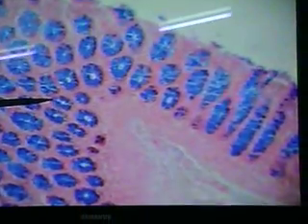There we can see some of the blood vessels, some of the colic vessels that are going there, and there we see the mesothelial lining out here. So that's a very nice slide. Now let's look at the vermiform appendix. Yeah, that's a nice slide of the appendix right there.